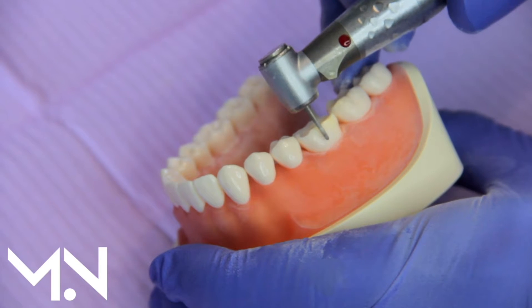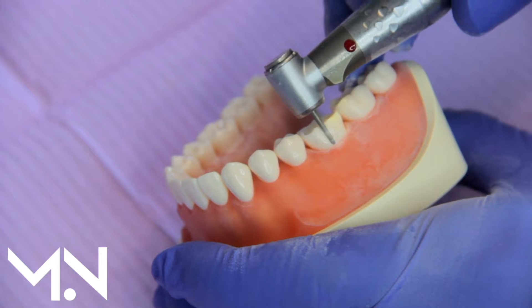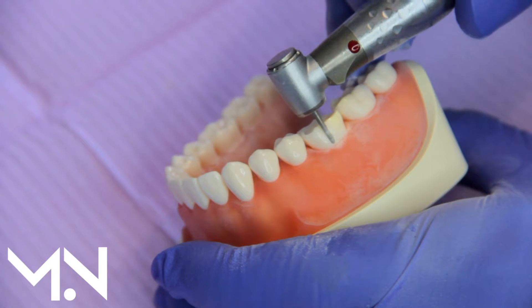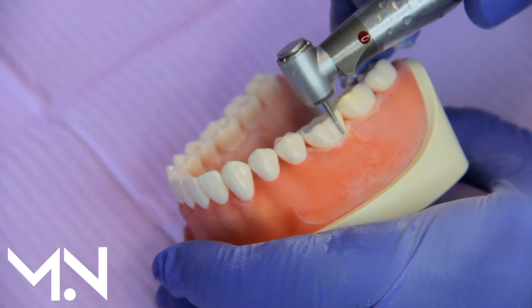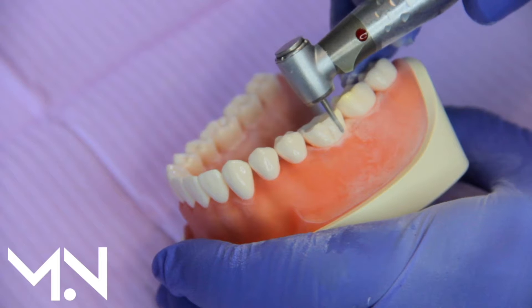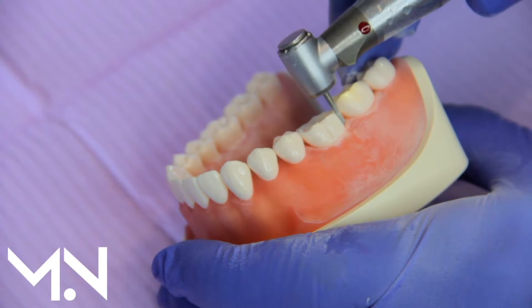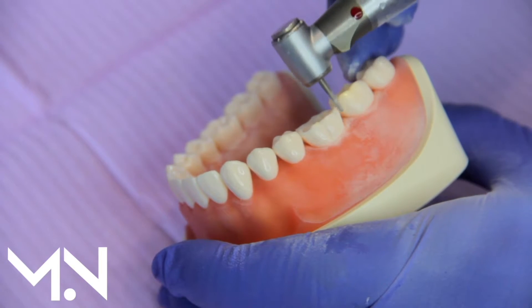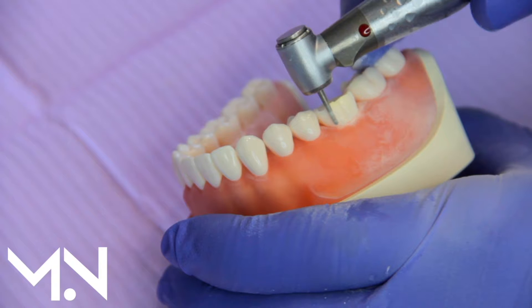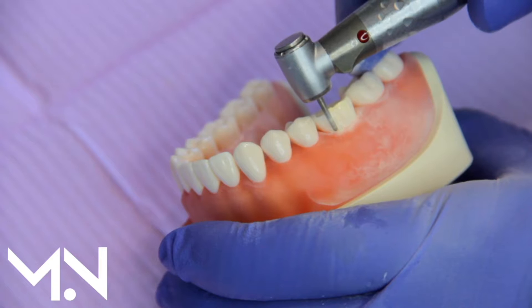Same idea — I go ahead and place my grooves again. Depending on the material, different reductions apply, but a rather common reduction amount is one to one and a half millimeters. Once I have a few of these grooves, I can start joining them again.